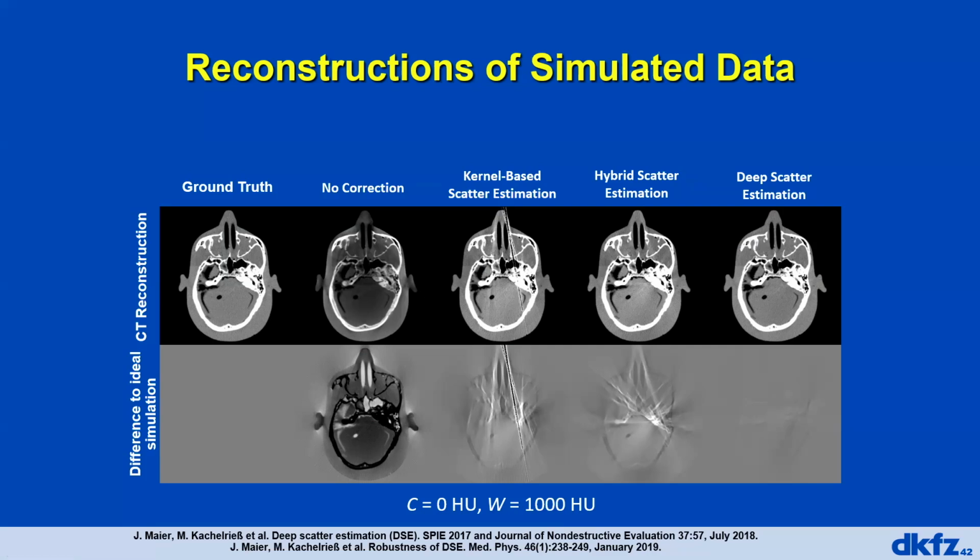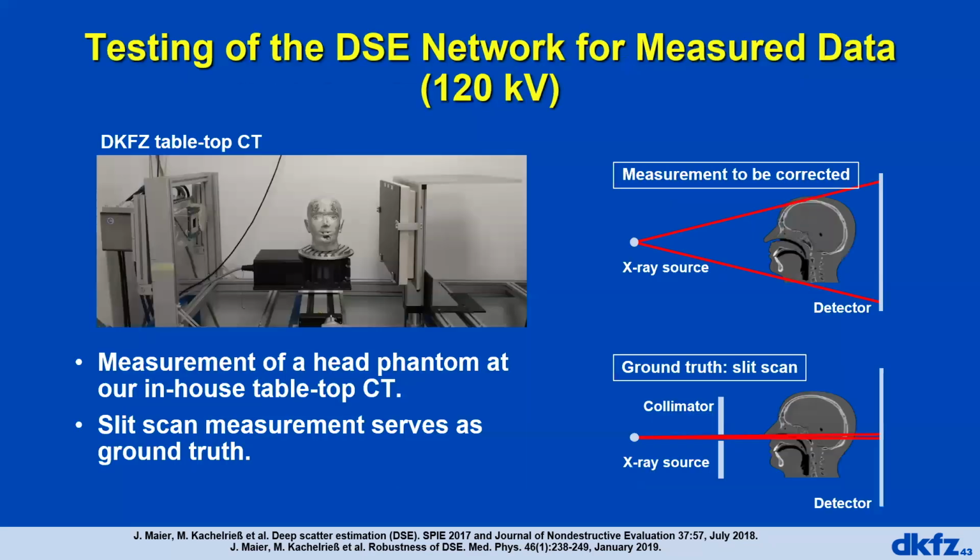So what we actually do here is we use artificial intelligence in neural networks to speed up very slow and costly computations and basically make that able to run in real time. This is what we did here. We also not only simulated that, of course, we also measured that using our in-house tabletop setup.